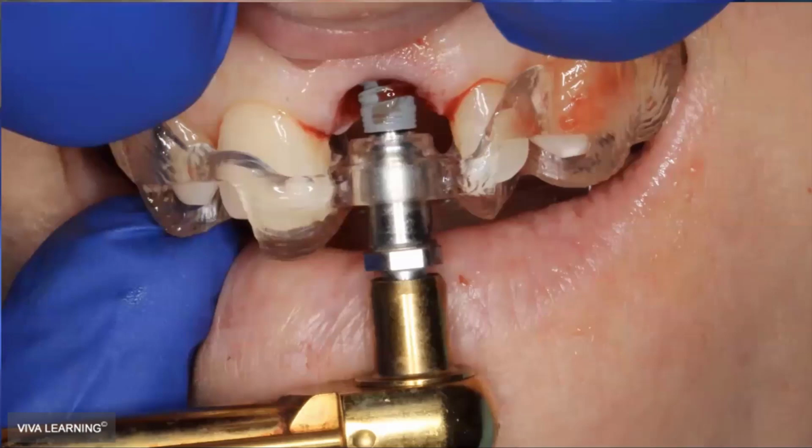And this time it's a 4.3 by 10. We didn't need to go as long as we did last time. The head of the implant is at the exact same level that I planned it last time. It's just 3 millimeters shorter because I don't need to get into that apical native bone like I did if this was an immediate implant.